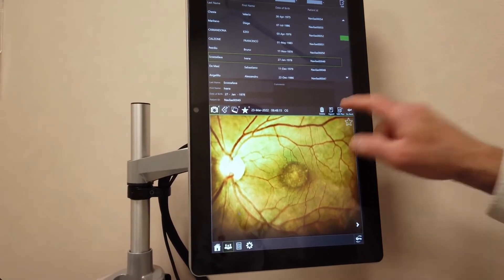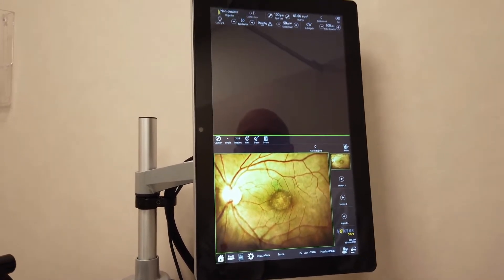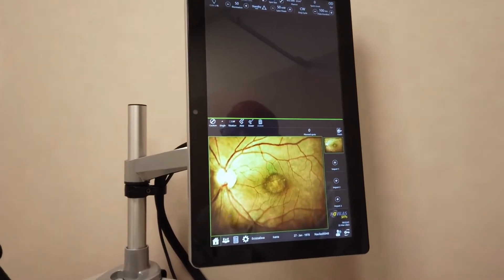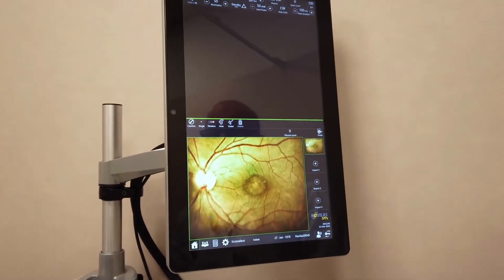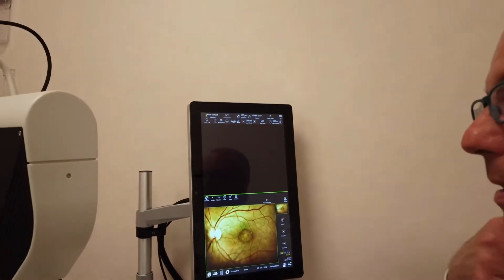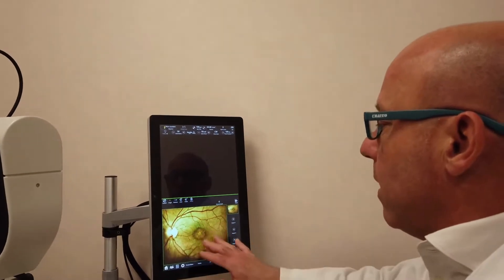You choose this small edit plan button where we have the option to build the treatment, because the treatment has to be carefully constructed before it is performed. Usually with other lasers, we directly perform the treatment on the retina, whereas with this type of laser, we have to plan it beforehand.